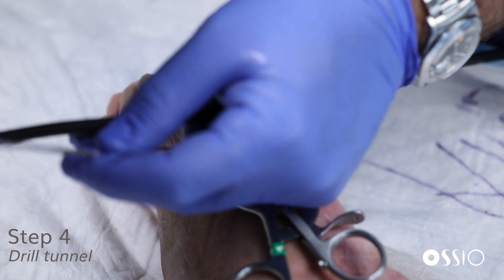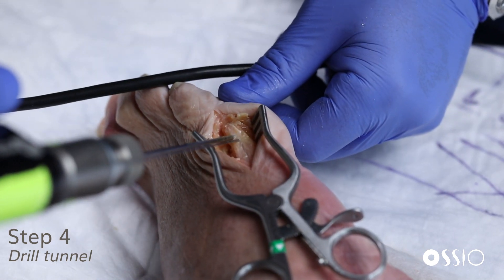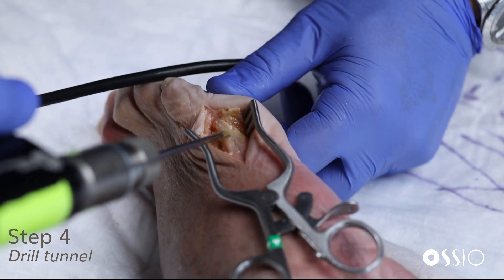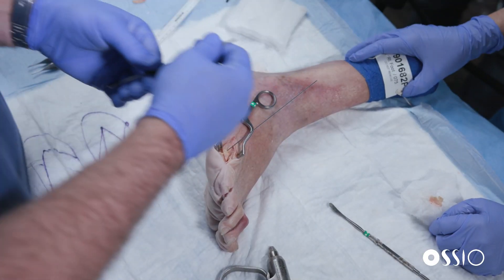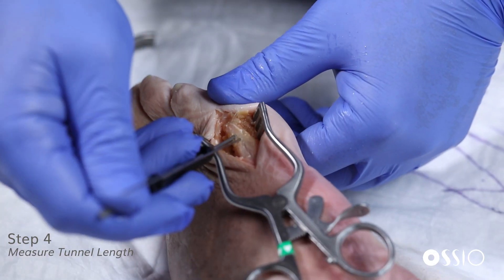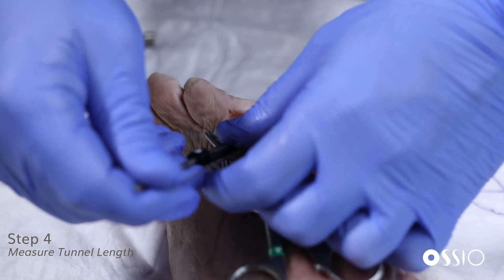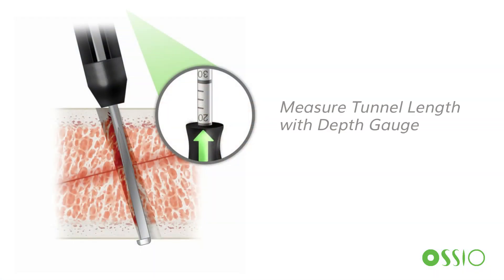A bone reduction clamp is useful here if you need to maintain compression against the nail. The idea of the fixation nails is to maintain the compression achieved either through the K-wires or through a bone reduction clamp. We've drilled bi-cortically. Now we insert the depth gauge and hook the distal cortex. Reading line to line, this is designed to be just slightly bi-cortical, so you want just a little bit of the implant proud dorsally and plantarly to achieve good fixation.